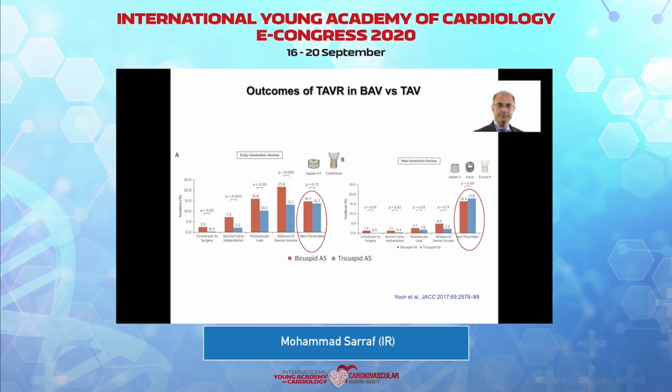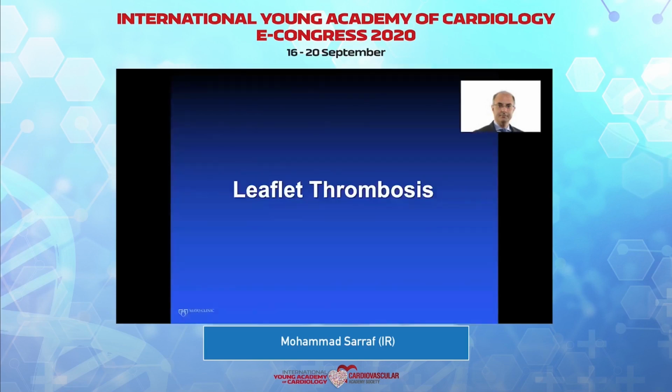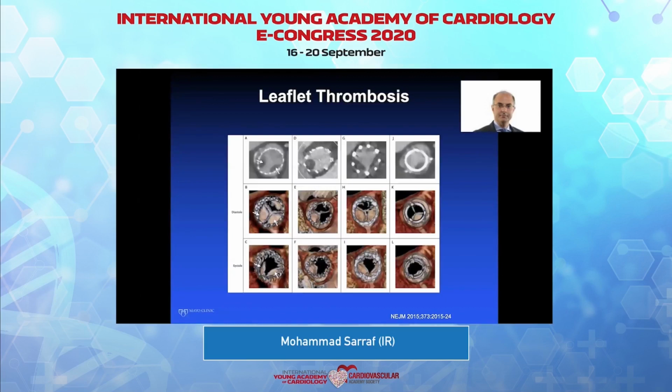Leaflet thrombosis is a very important topic that has been raised over the last 5 years. This is a famous paper by Raj Makkar, who clearly showed that it's present both in surgical bioprosthesis as well as TAVR, but clearly it's more common to be seen in TAVR.